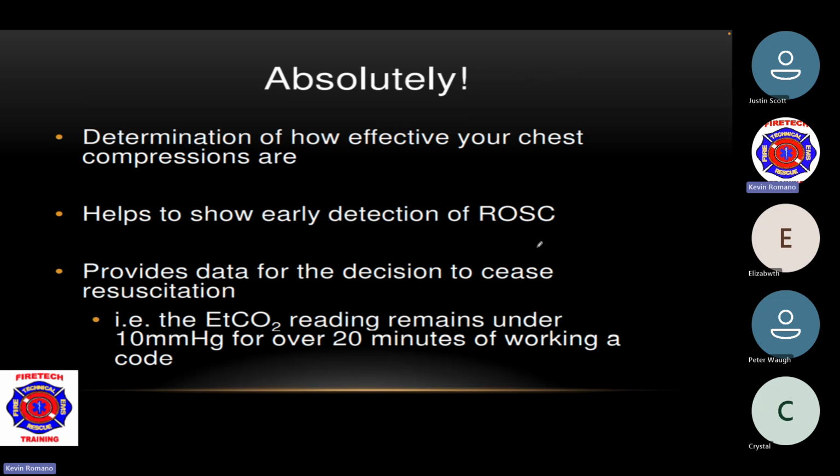So you look at it again, so if we have a patient in cardiac arrest and they're asystolic for 20 minutes, we need to call it in the field, right? If their end tidal is 0 and their heart rate is 0, and you confirm in 3 different leads that they're asystole, the patient is deceased. They are dead. We can do time of death. We can call it there, right? It's one other thing we can utilize to help with this.